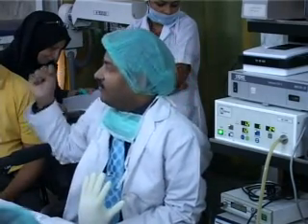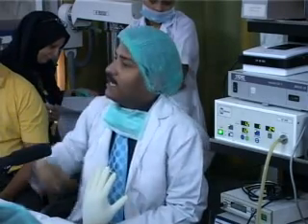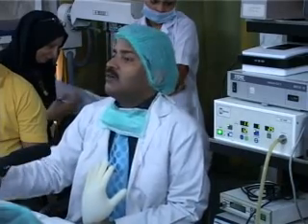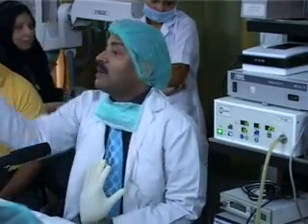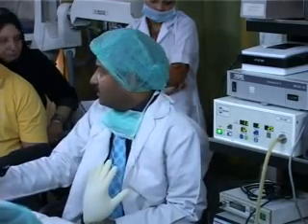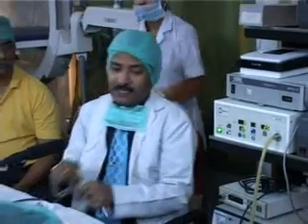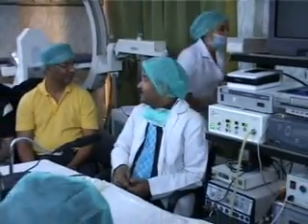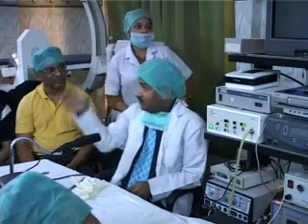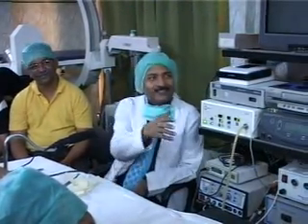So remember, if within 5 seconds you could not introduce it, stop and then press again. If you keep on continuously pressing, then there is a danger of injury to the bowel or viscera, because the abdomen will collapse, because the insufflator will take the gas back. So suppose this is the trocar and cannula and you are pressing like that. This way, if you are putting it, you have to take care that the pressure should not be there, otherwise the abdomen can burst.